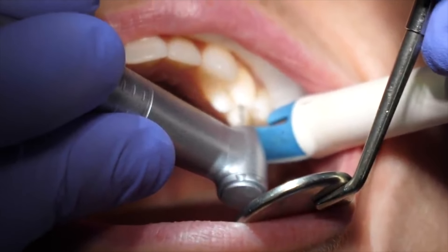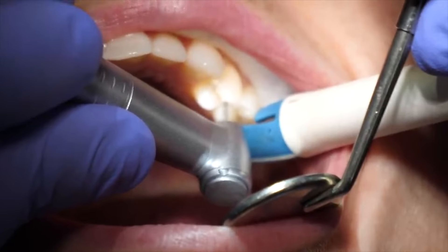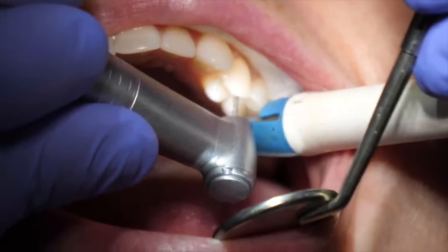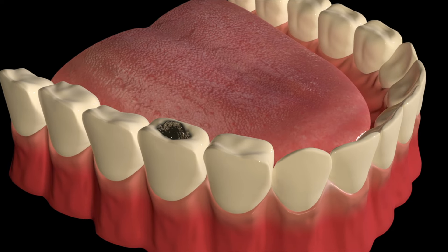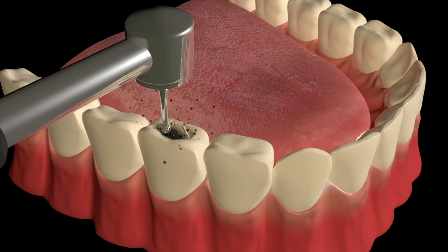In this video, the dentist is using a drill to remove the cavity out of the tooth, starting with a high-speed handpiece, which is a high-speed drill. Here's an animation for you to better see what's going on. Deep inside of the tooth, there will be darkness — you can see the decay.